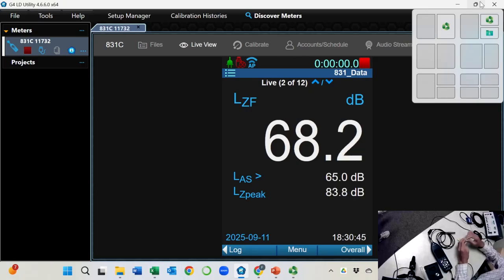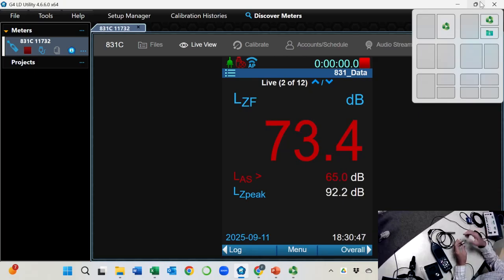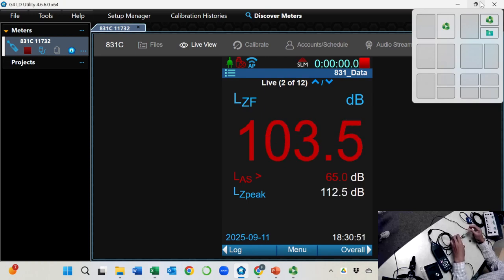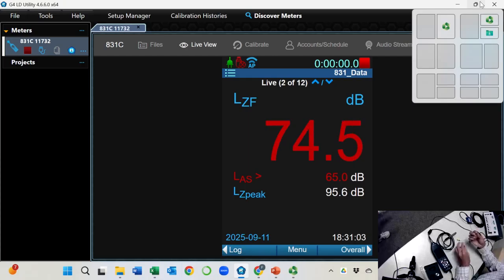Okay, pretend it's in order. You have to do it all the way in, and then shuffle it in, and that's how you use the HA1 coupler. It's very simple, the first style coupler. But this one is troublesome because I could lose this. So over time, I prefer HA2.